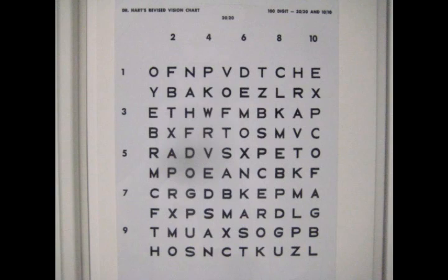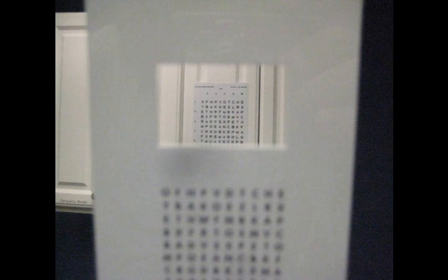Please wear your correction, whether it's contact lenses or glasses, with the eye patch over your right eye. To begin this therapy technique, look at the distance heart chart on the wall and try to make the top line of letters clear as fast as you can. When looking at the distance chart, you can either look above the handheld chart or through the small square on the handheld chart, whichever is easier for you.